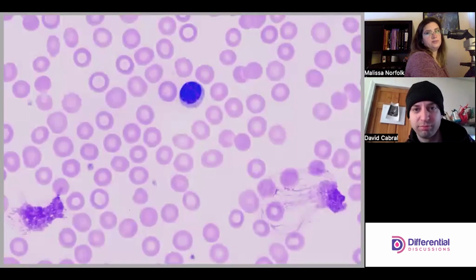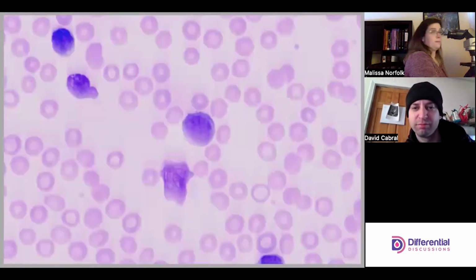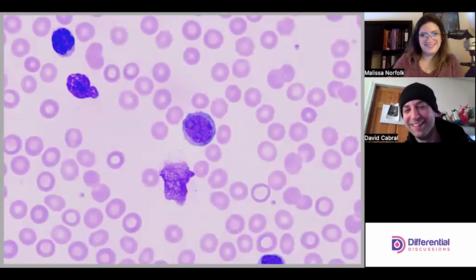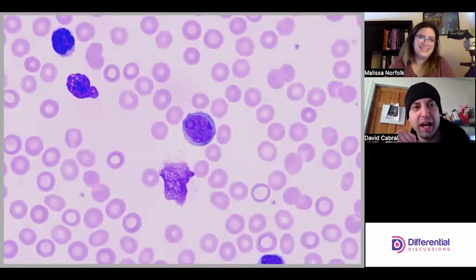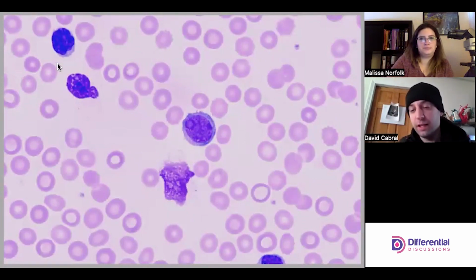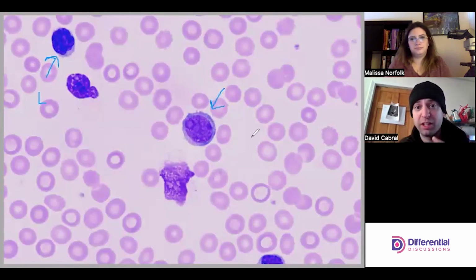Some more smudgies. And a lymph. I always like when you have a normal or normalish cell and then the abnormal cell. On my screen, top left is a really condensed resting lymph. And then center-ish field, we have a chromatin pattern that's much more loose and a very prominent nucleoli, suggesting some level of immaturity, right? So these are the findings.